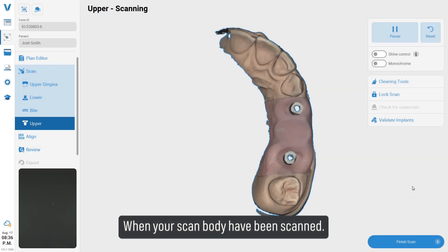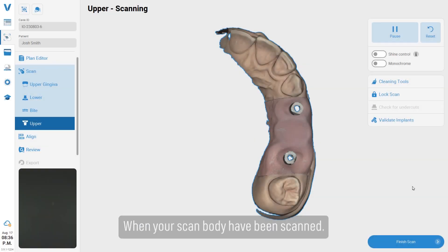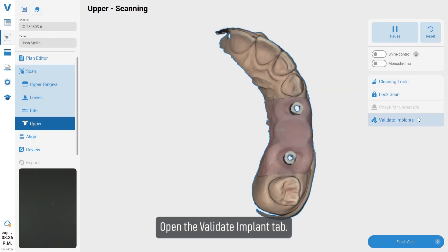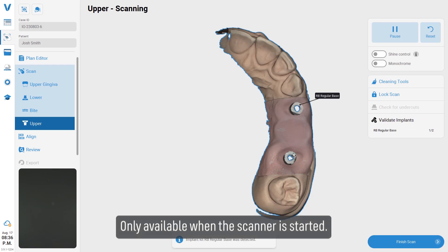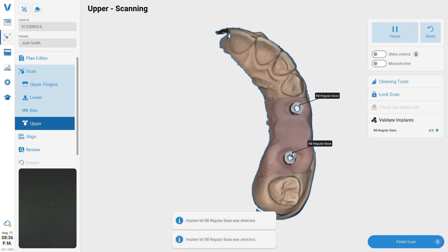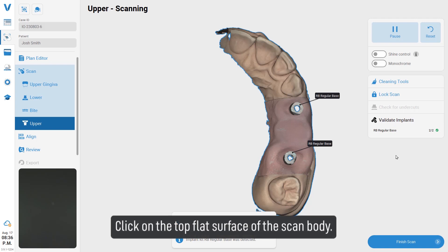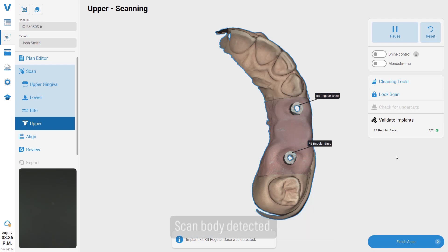When your scan body has been scanned, open the Validate Implant tab — only available when the scanner is started. Click on the top flat surface of the scan body.